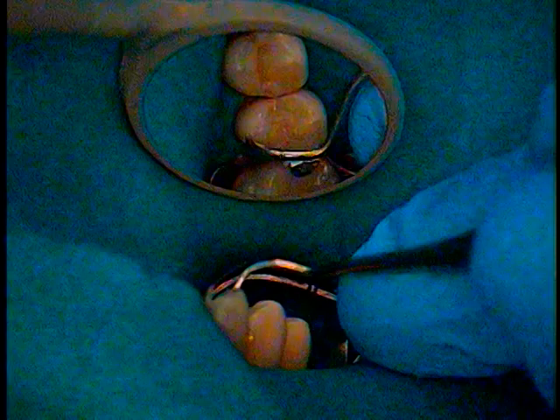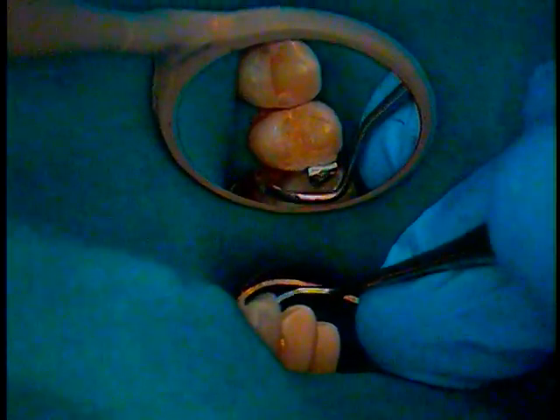Okay, while we're getting that, I'm going to take off the clamp. Incidentally, they're cured with the same light, identical. Okay, now, just because I'm a little anal retentive on some of this stuff, I like to go ahead and pull back the sides of the band and just cure from the lateral aspect. I'm going to do a 20 from each side.